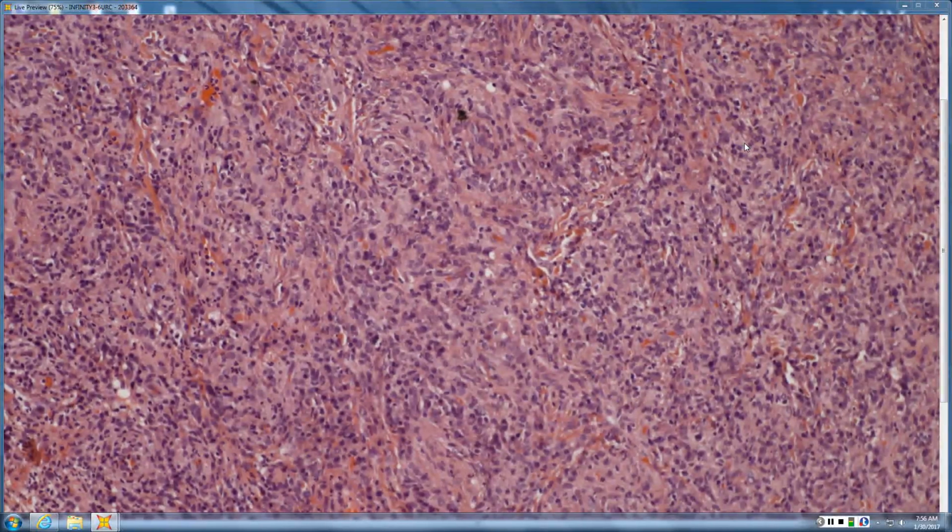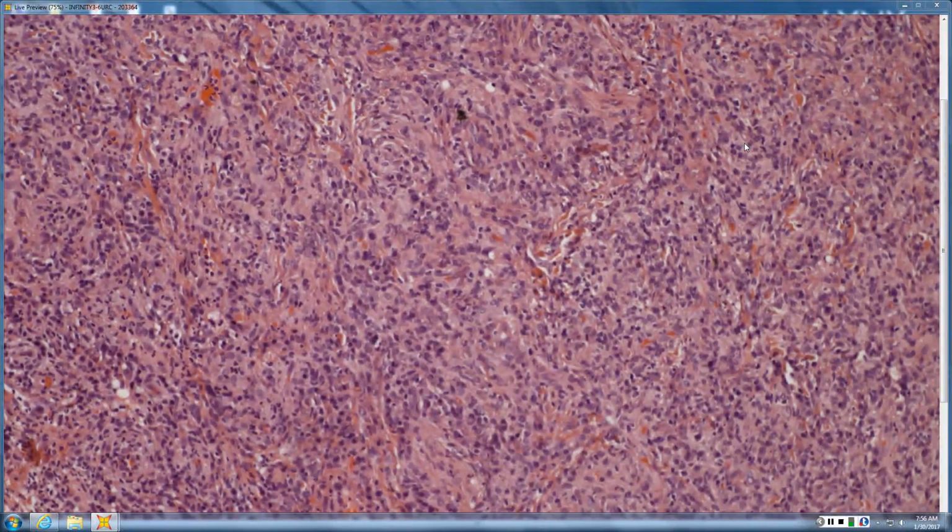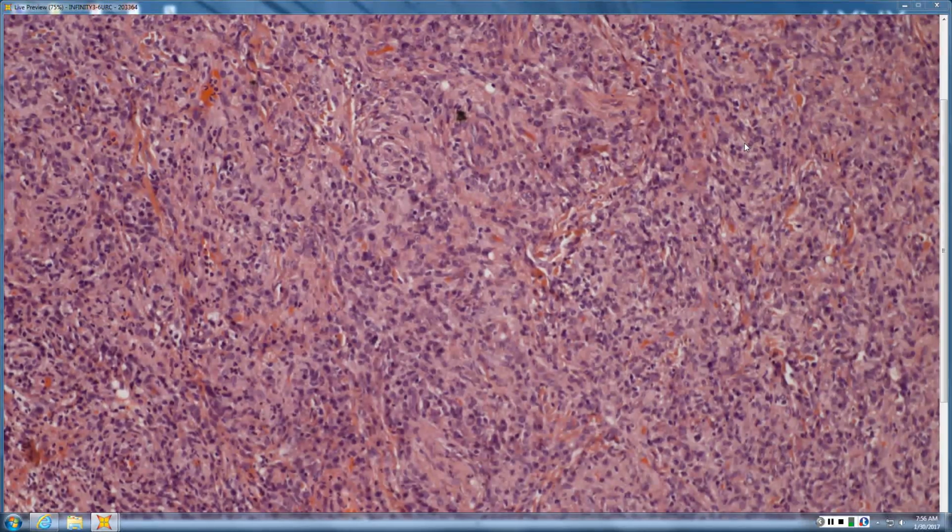So you're absolutely right that you have to maintain a differential. This is an immunosuppressed patient with an ulcer, with granuloma, with plasma cells, and you have to think, what are all the atypical infections that will cause that? But as you're thinking acid fast and fungal, don't forget spirochete in that differential. Syphilis is at levels like it was back in the 1920s, and if you are not seeing syphilis, it may be seeing you in practice.